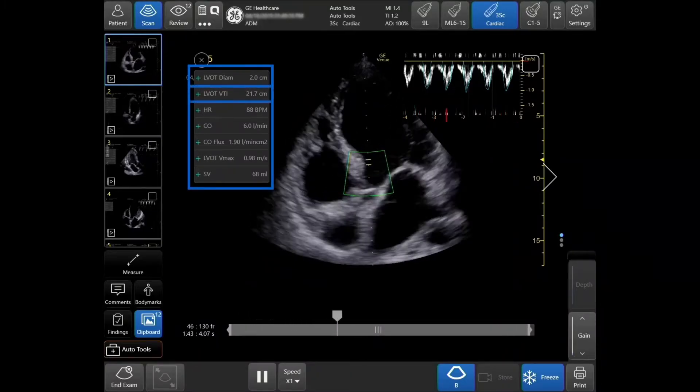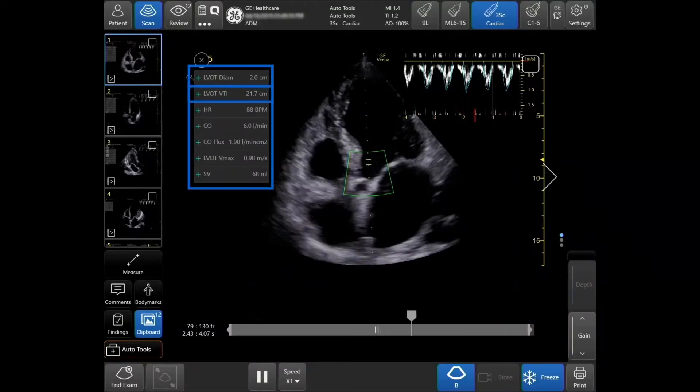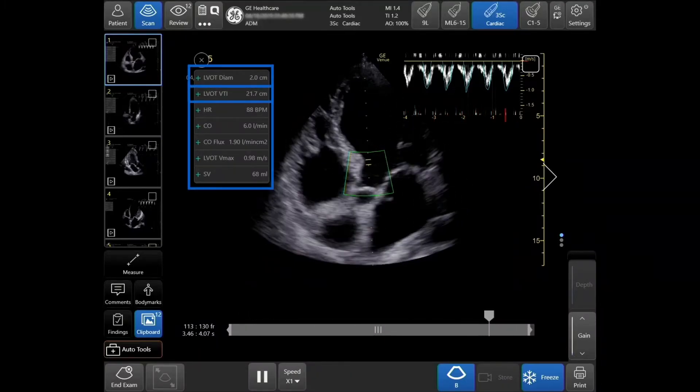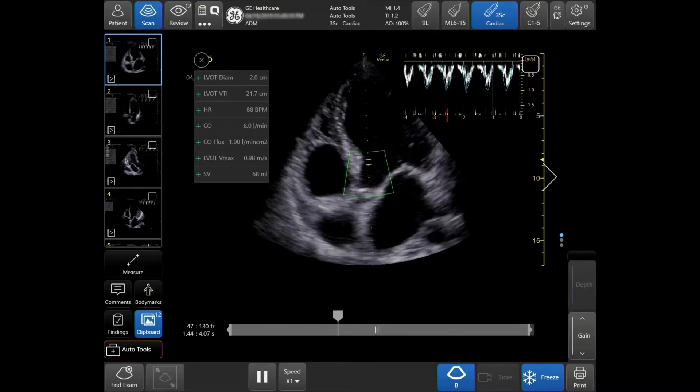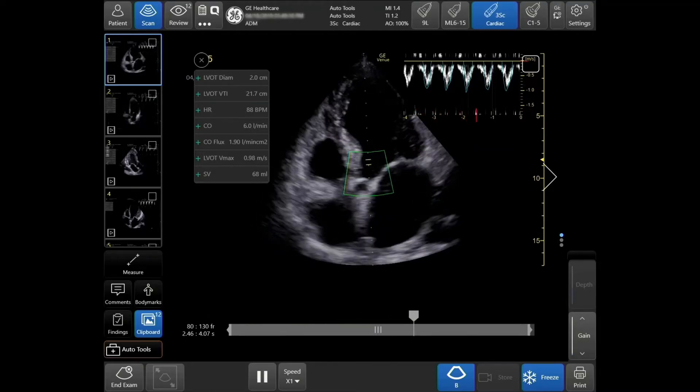It will display alongside my LVOT VTI. If unknown, an LVOT diameter will need to be acquired.